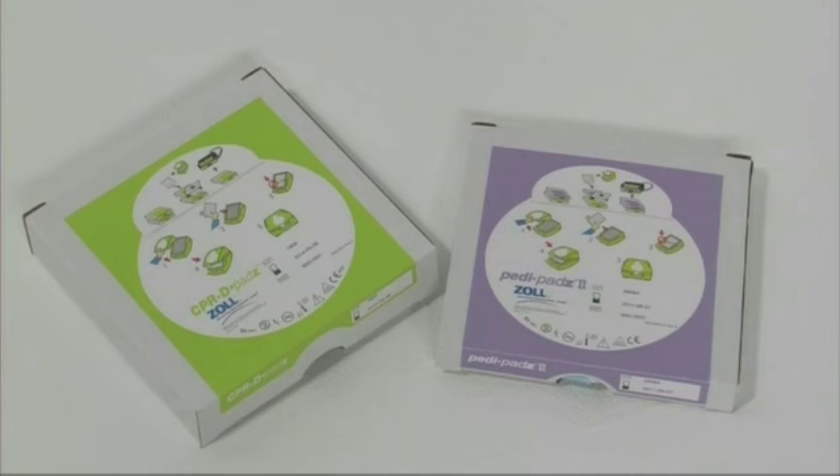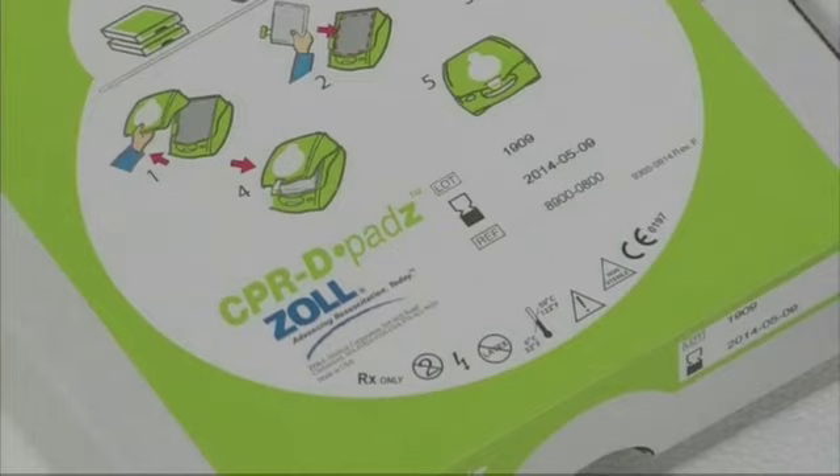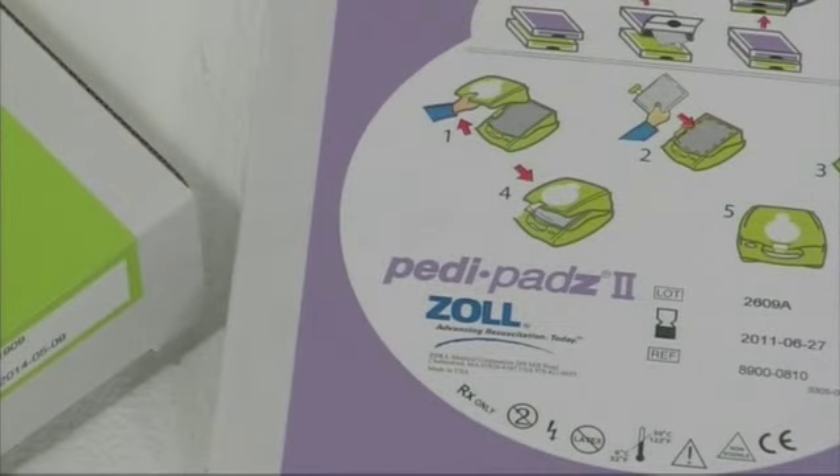Make sure that the electrode pads connected are appropriate for the victim. Adult pads are labelled CPR-D pads. For children under 8 years old or 55 pounds, Zoll's paediatric pads should be used.